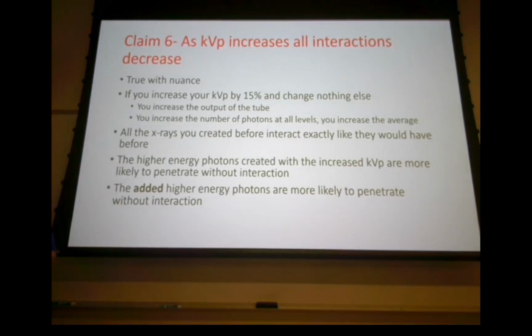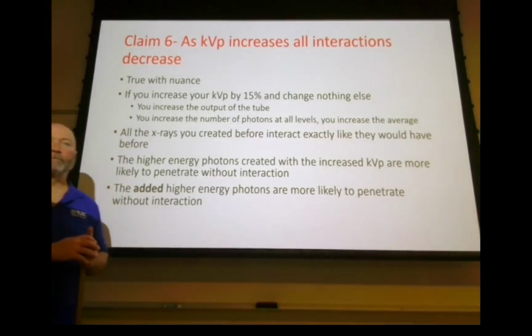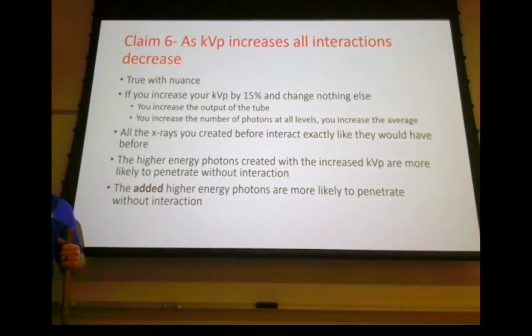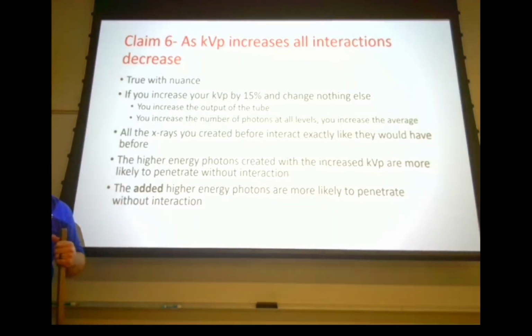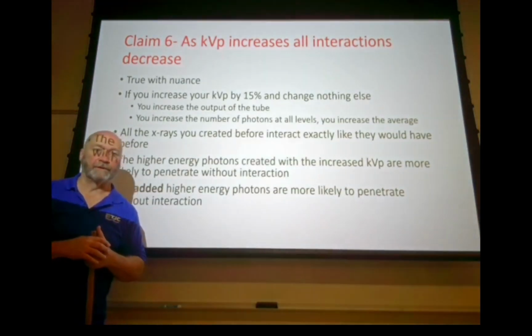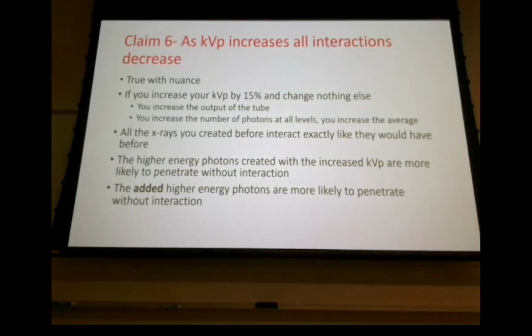So would you ask as a number, maybe? Probably I would ask more of a percentage. Yeah, as kVp increases, what happens to the percentage of penetration, what happens to the percentage of Compton? They all go down. Or the penetration goes up, but the Compton and the photoelectric go down.